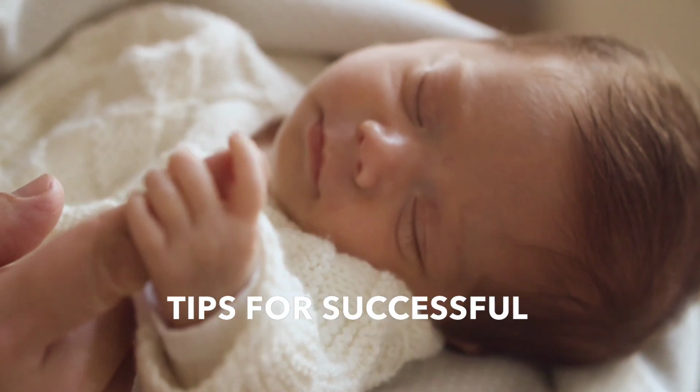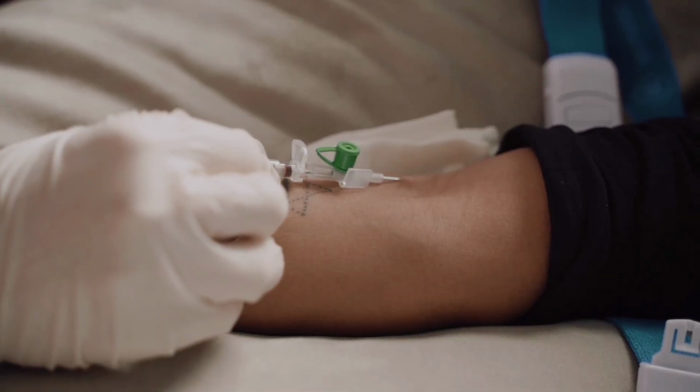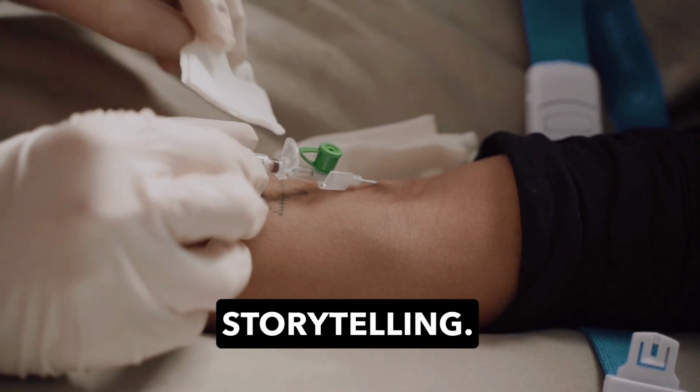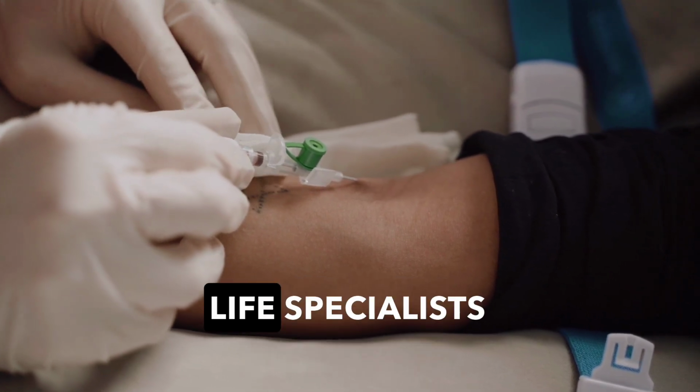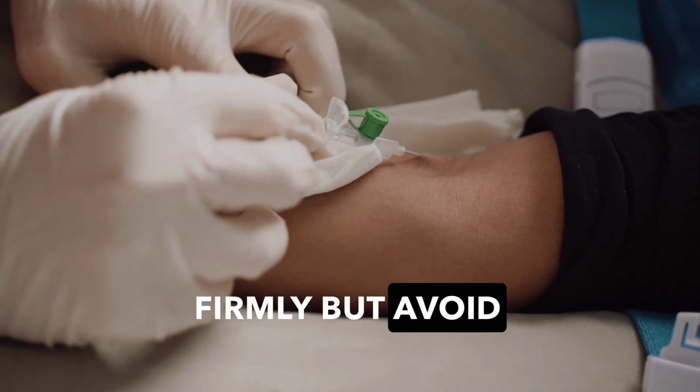Tips for successful cannulation in children: use small gauge cannulas to minimize trauma. Employ distraction techniques, for example, singing, storytelling. Involve child life specialists if available. Secure the cannula firmly but avoid restricting movement.